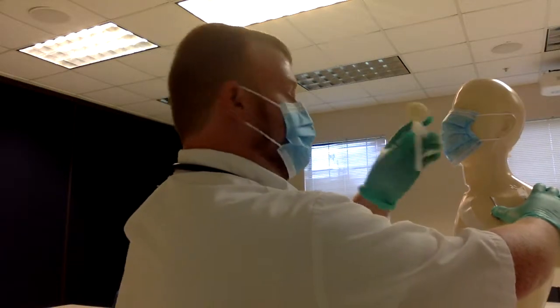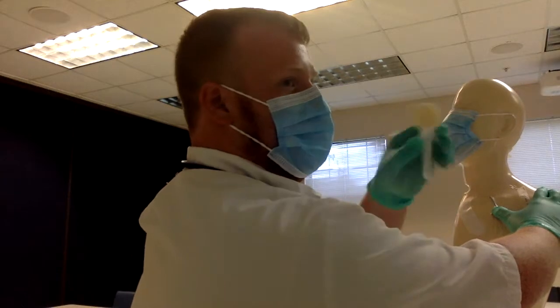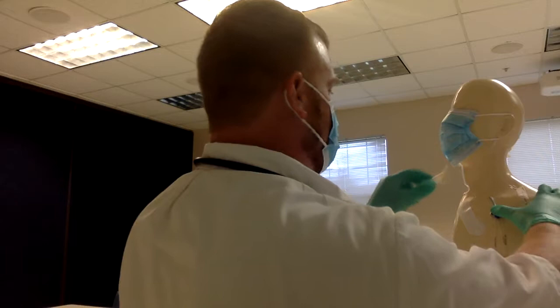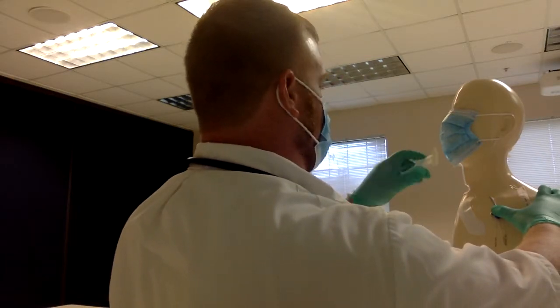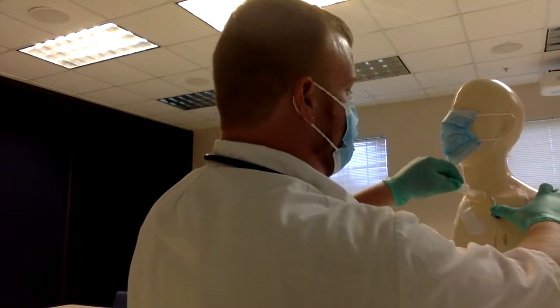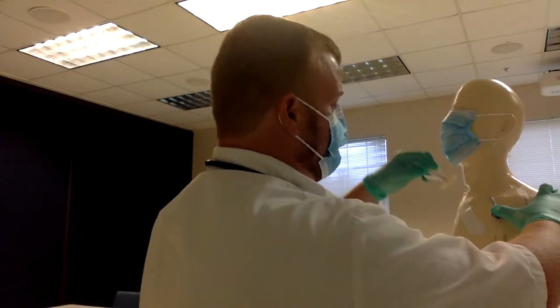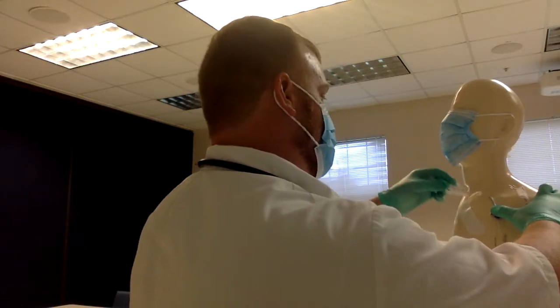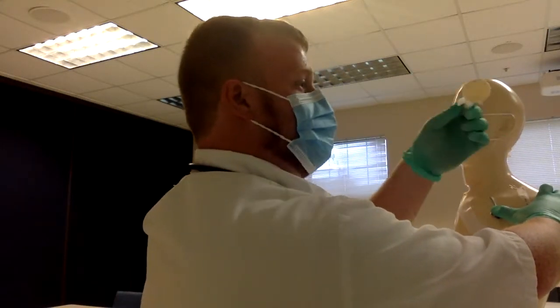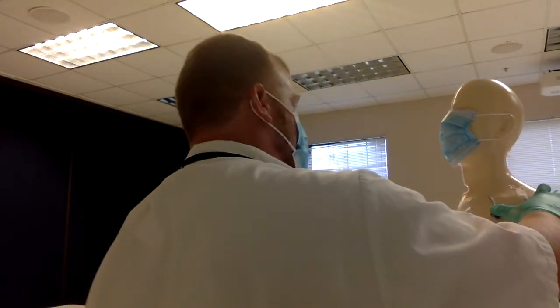I have a chlorhexidine sponge here. You crack it and you squeeze, and you let the solution fill up the sponge. Different medical professionals have their own different techniques. Basically, you want to start closer here and gradually work away. Each time you put the sponge back down on the patient's area, you're going to use a different part of the sponge. In theory, you want to use the top, the side, the front, and move away from everything. This one is now done, so it's trash.